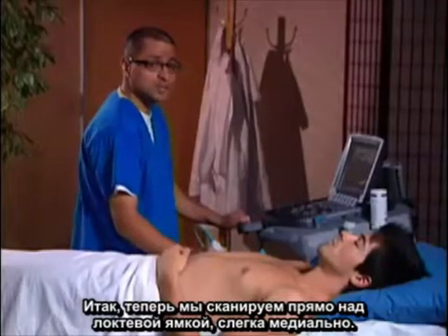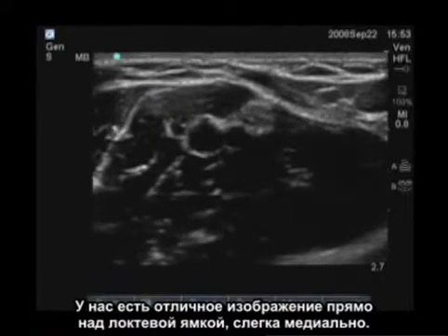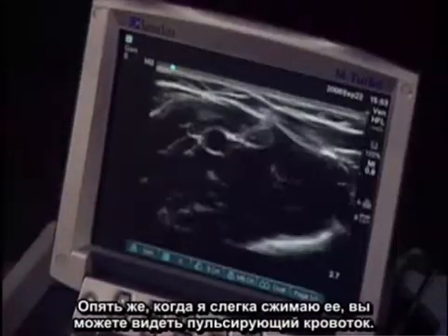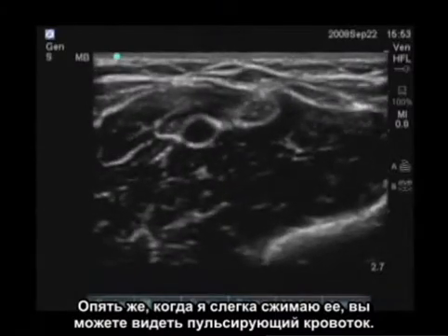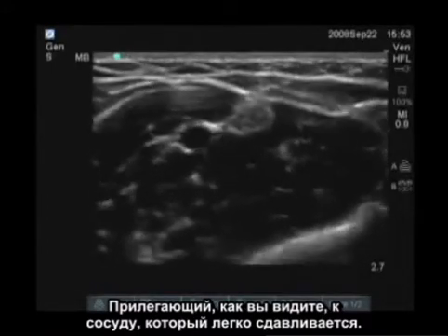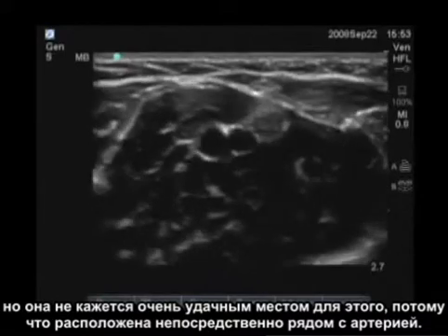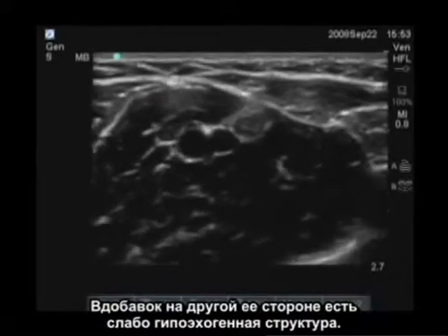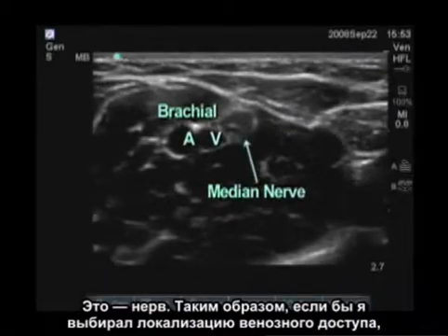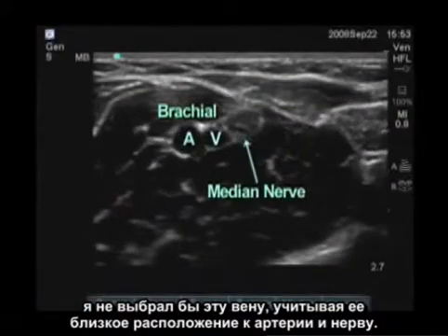We're now scanning just above the antecubital fossa, a little bit medially. We see a few structures to point out: there's an artery in the center — when I put a little compression on it, you can see pulsatile flow. Adjacent to that is a vessel which easily collapses, representing a venous structure that could be cannulated, but it's not in a great location because it sits right adjacent to the artery. On the other side is a slightly hypoechoic structure representing the nerve. So I would not choose this vein given its proximity to both the artery and the nerve.